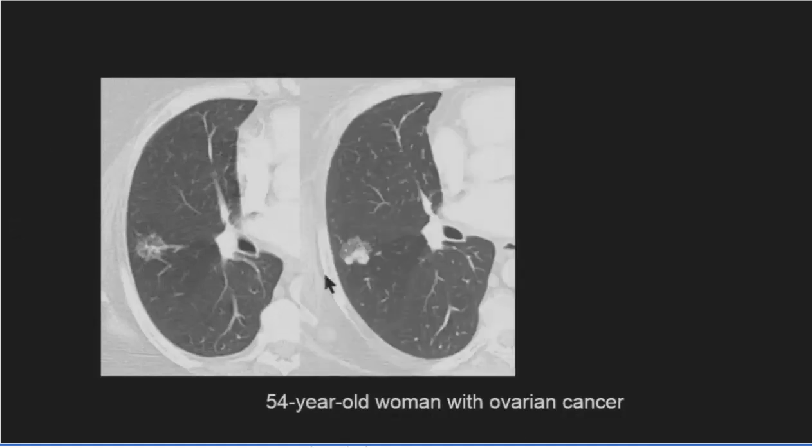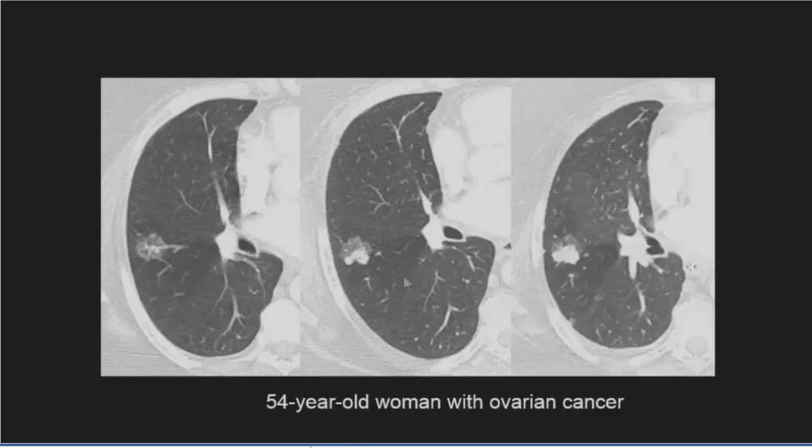A 6-month follow-up was performed, and we can see now a solid component within this lesion. So it was biopsied but showed organizing pneumonia. To confirm resolution or stability, a new follow-up was done in 6 months, but now we see the solid component has increased in size. So our concern for adenocarcinoma increases, and a rebiopsy confirmed a primary lung adenocarcinoma.